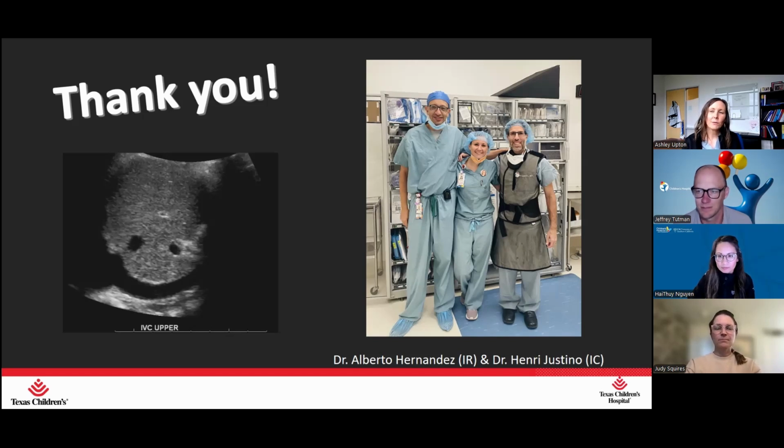But if it's straightforward, I mean, are the hepatic veins patent? You can see patency on color and grayscale. So we're actually trying to get away from this full spectral Doppler, right upper quadrant with Doppler on every single one of these patients, just because it's extensive and it's time consuming. So I think that's a great question.